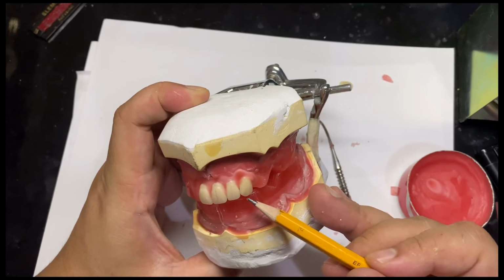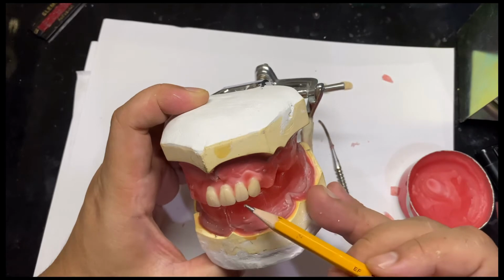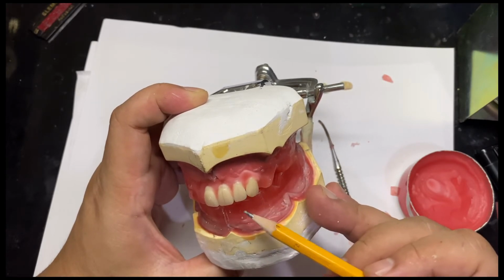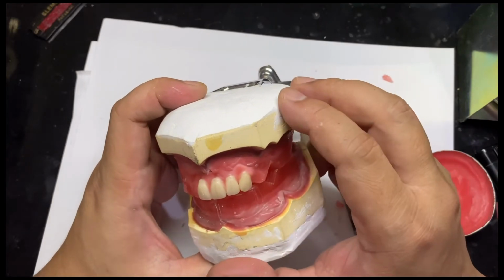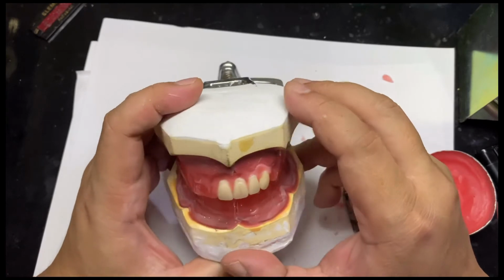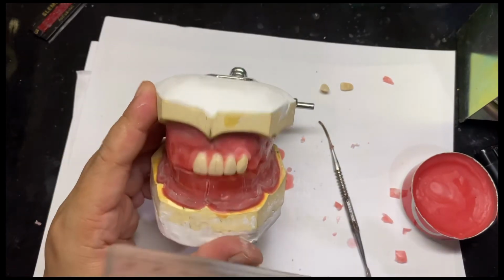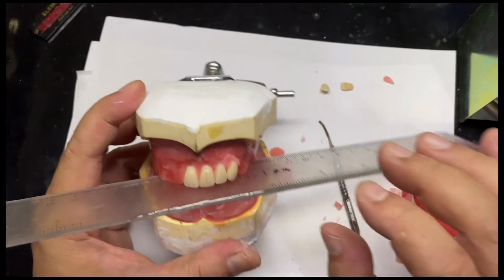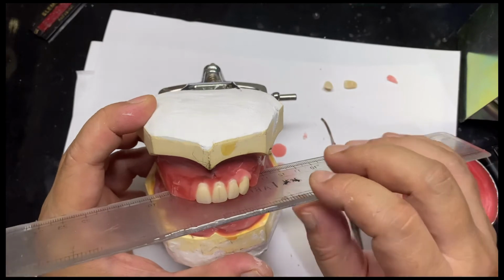All the tips, central, canine, except for the lateral, which should be 0.5 or 1 millimeter above the occlusal plane, or above the incisal edges of the canine and central incisor. Now you may also use your Fox plane to check whether the incisal edges are on the level of the occlusal plane. I only use this ruler to check.